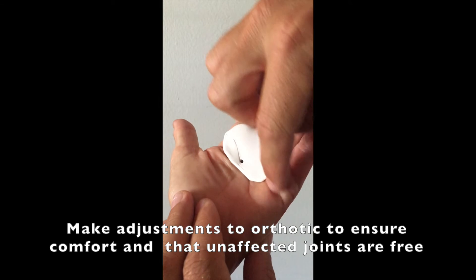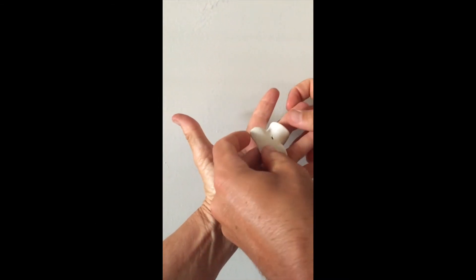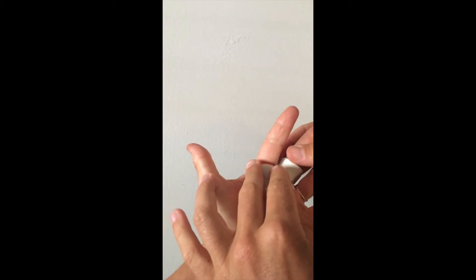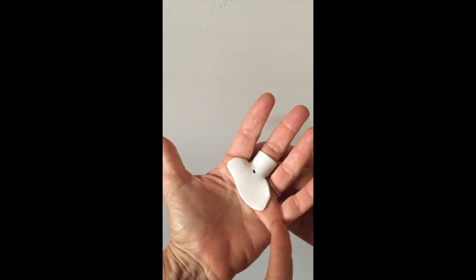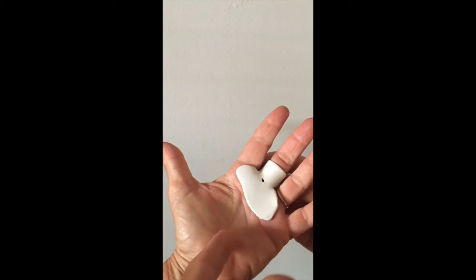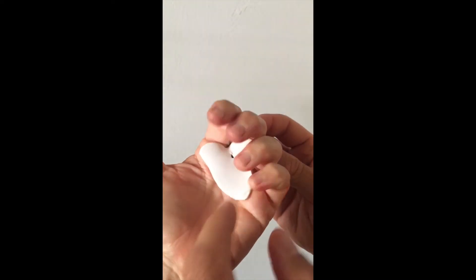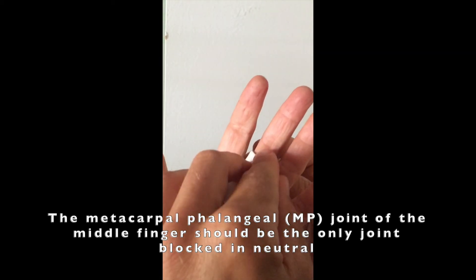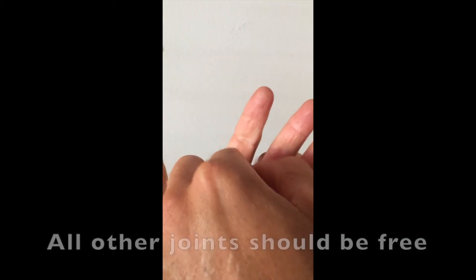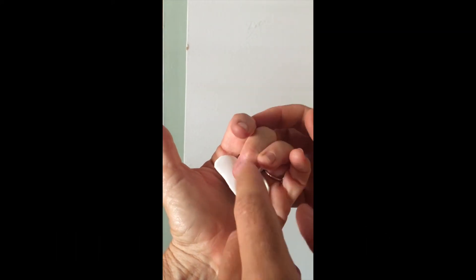You can see the palmar crease here, so we're just going to make a line here to cut through that. The palmar crease is right there and we're going to cut through that too. Okay, let's try this on again. We have good clearance with the palmar crease. Can you bend down your fingers? Good — the metacarpal is blocked and the PIP is fully free. We might bring that down a little bit more, but the PIP joint is completely free to bend, which is good.